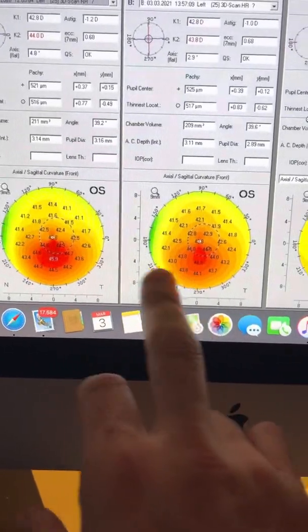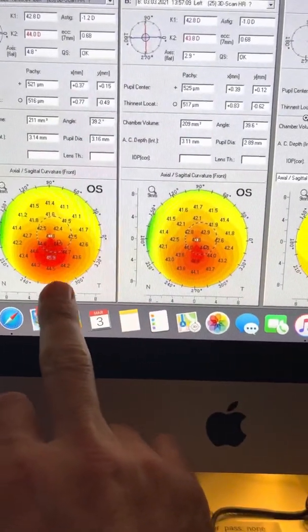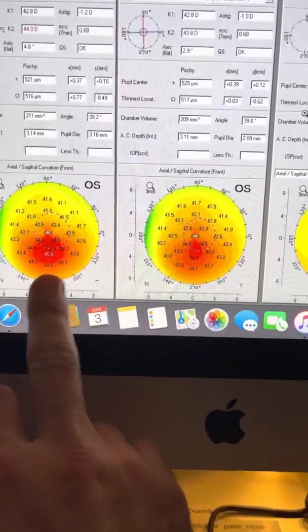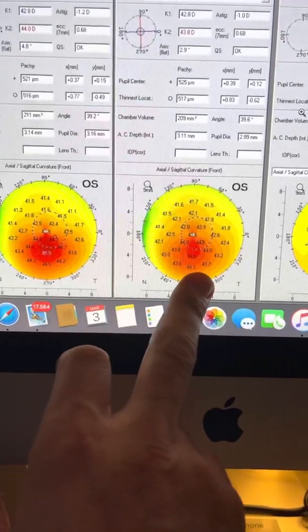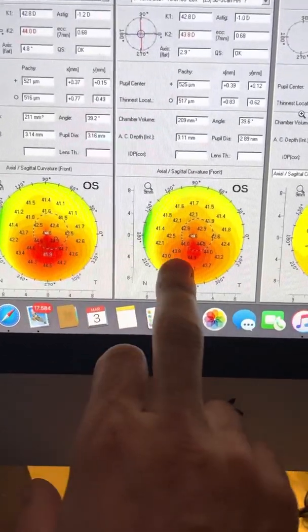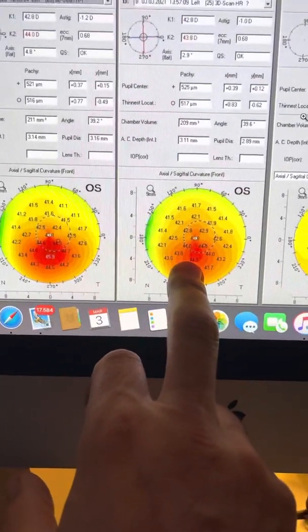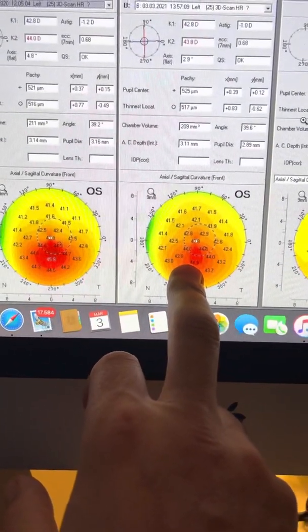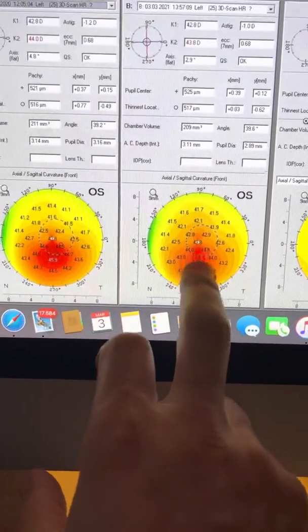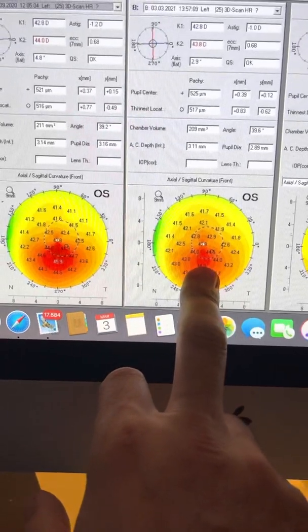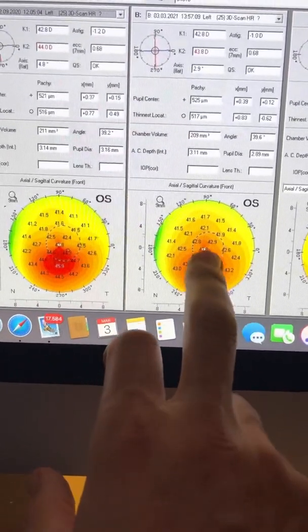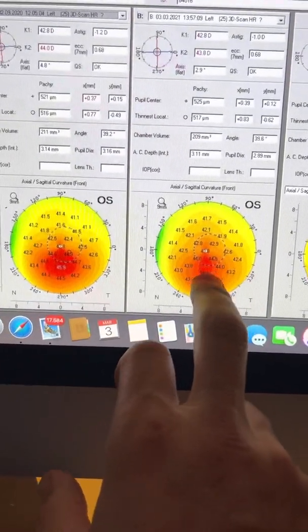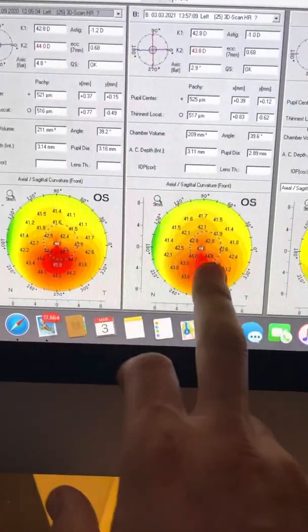And I want to add here that there is no treatment that took place between these images. He has flattened one diopter at the prior cone peak, but it's not only that. The whole cornea is normalized.